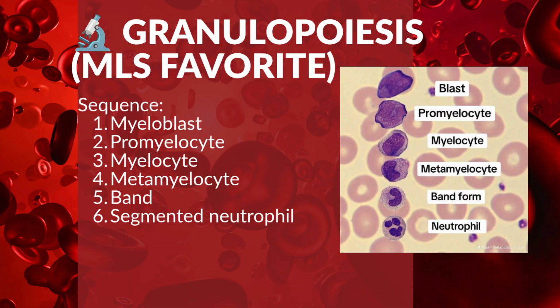Segmented neutrophils. I'm fully grown. I'm on my own. You can't tell me nothing. Give me the keys. I got to go.